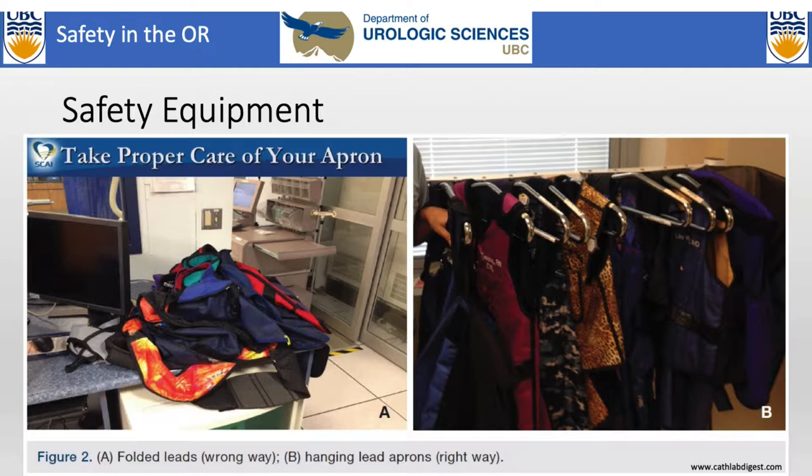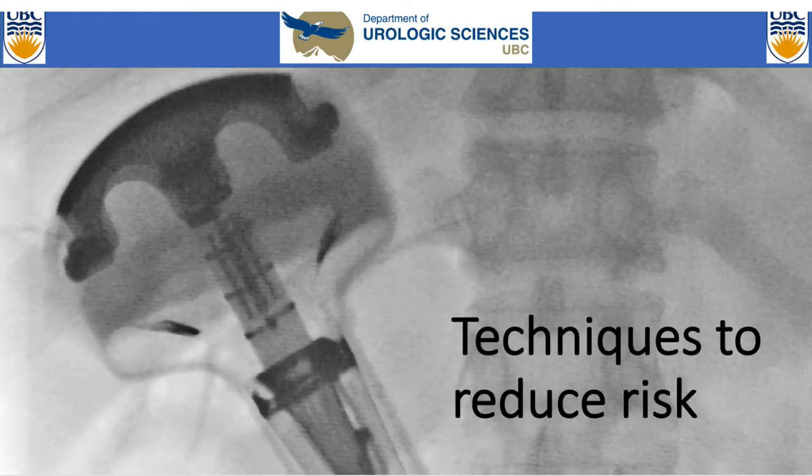And these should get checked by people in, I believe, biomedical engineering once a year is the minimum. And they actually take x-rays of the lead if there are any concerns to see whether they're reasonable to use.